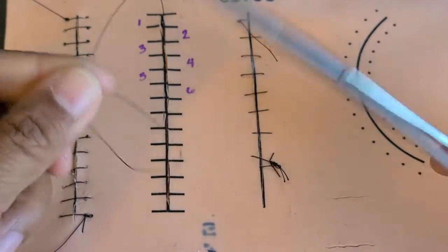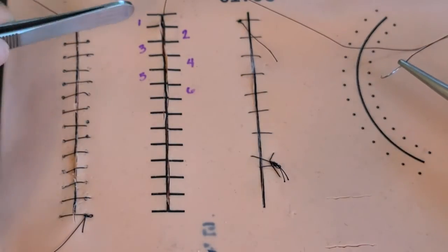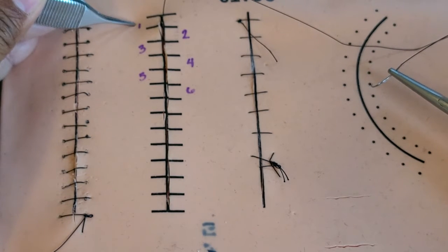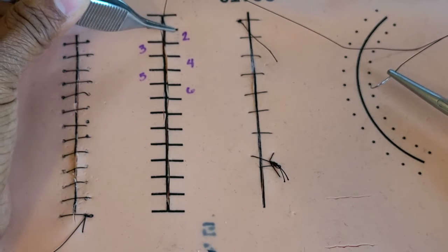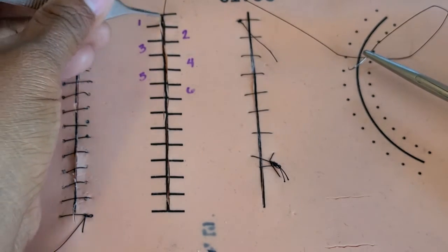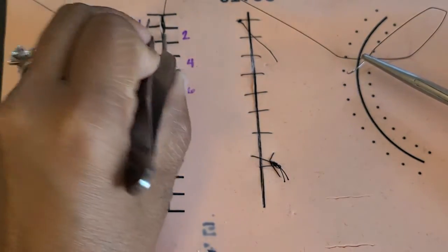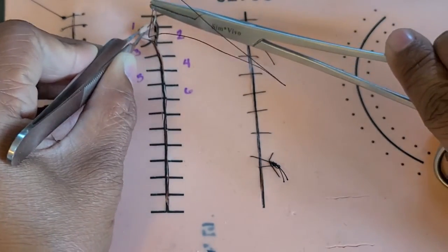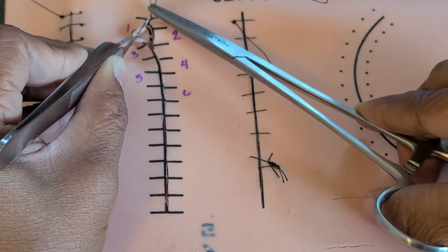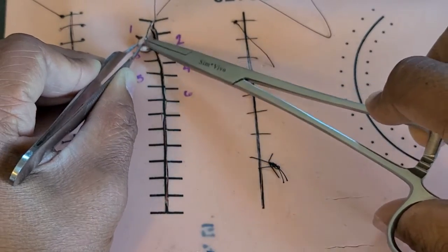From there, you reload your needle like you usually would, and you can see that I have this numbered. I have from this notch to this notch marked as 1. On the other side, from this notch to this notch marks 2. So this is the order in which I will be going with my needle and suture. I'm going to start off at the part of the skin, take my needle and go through that complete width from the apex to this first notch.